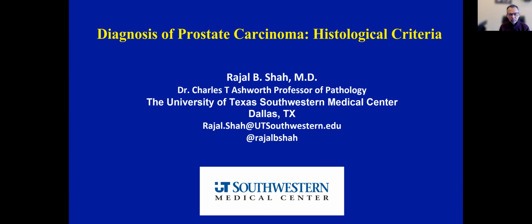In the first part, I will talk about the diagnosis of prostate cancer, and we will talk about the histological criteria that you can utilize to make a confident diagnosis of prostate cancer. And in the second talk, I will talk about the grading of prostate cancer. So let's get started.